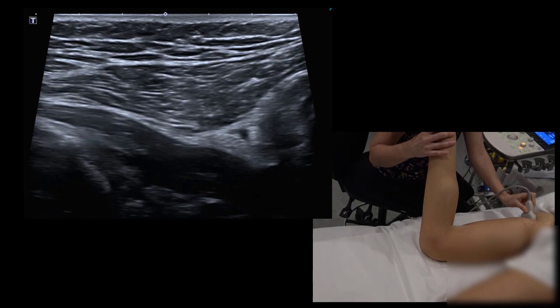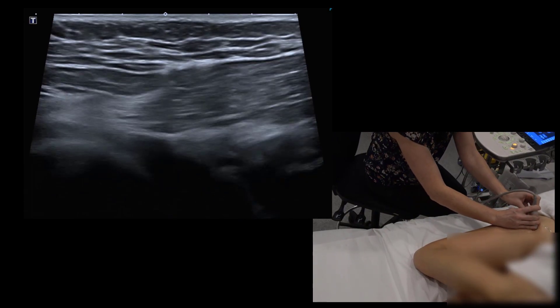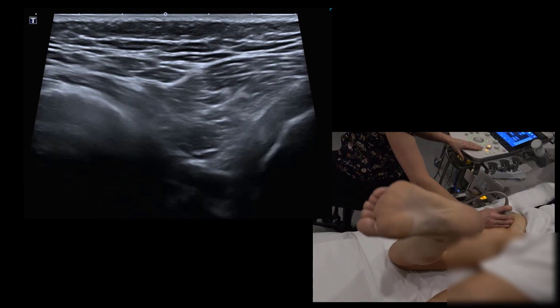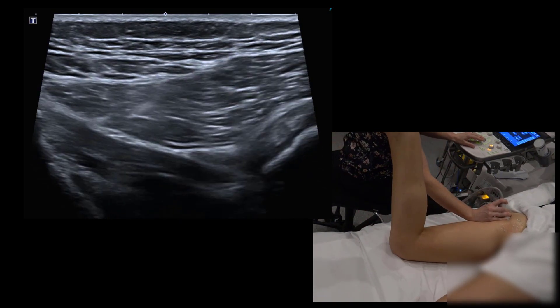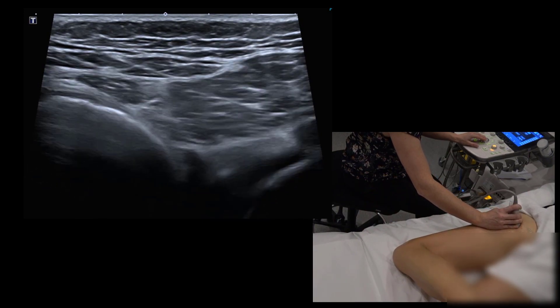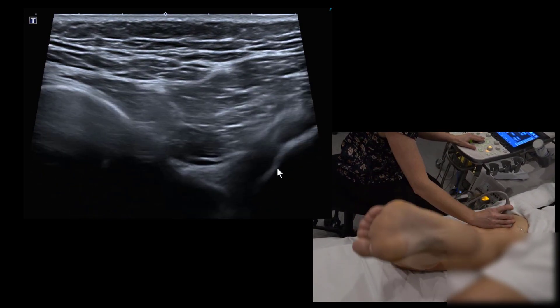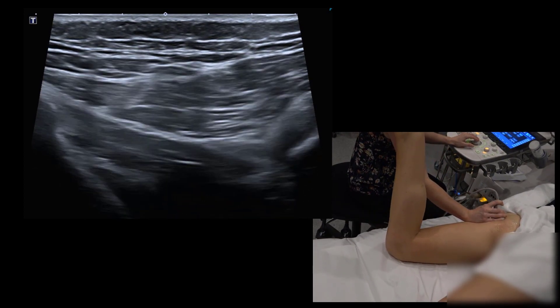Watch the sciatic nerve movement in this view — you can see it subluxes up and over the hamstring origin. We can also assess the semimembranosis: if it's detached or evulsed from the ischium, it can sometimes sublux into the ischiofemoral space.